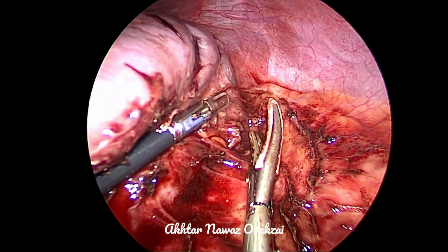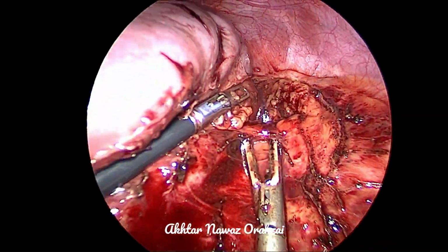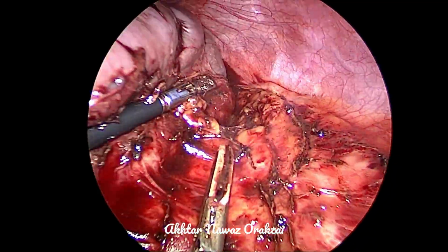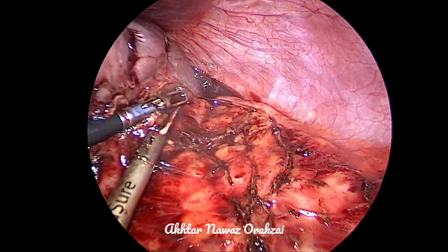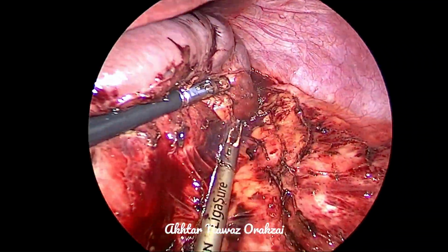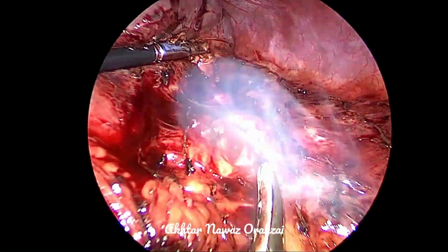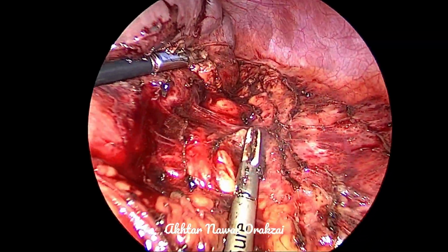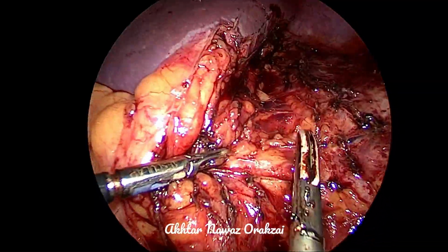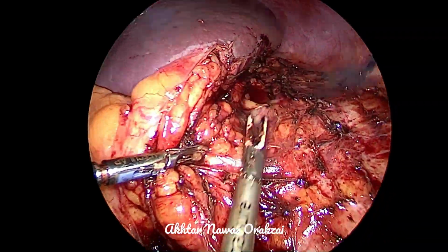We saw the edge of the liver above the spleen, so the liver is quite big as well, and the inflammation is reaching up to the upper pole and the adrenal, and you can see that here mobilization of the spleen is very difficult. All the tissues are inflamed and badly stuck. So there are chances of two kinds of complications.